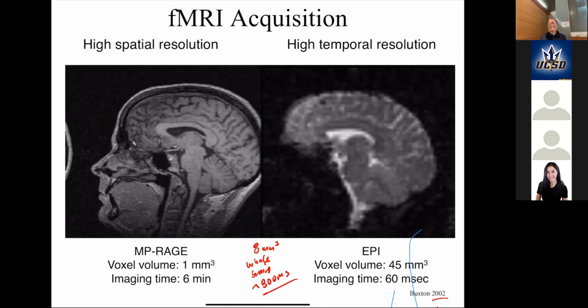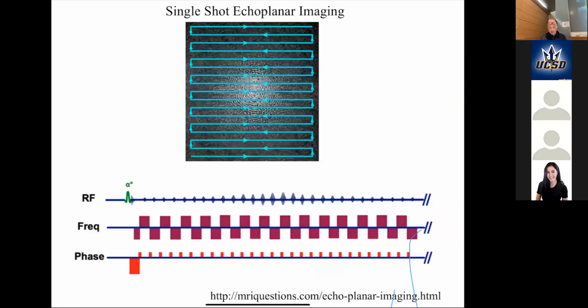So there have been really big increases in how fMRI works. The basic idea behind fMRI, the bread and butter sequence for most fMRI, is echoplanar imaging, which is also called EPI. So when you hear the term EPI, that's echoplanar imaging, and essentially it's a zigzag trajectory that allows you to go super fast.